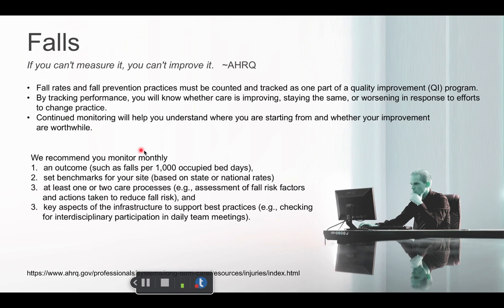Also, it's great if you can somehow track your falls. So show everyone how we're doing. Are we doing better? Are we doing worse? Are we helping our residents to reduce their falls, or are a lot more residents falling?